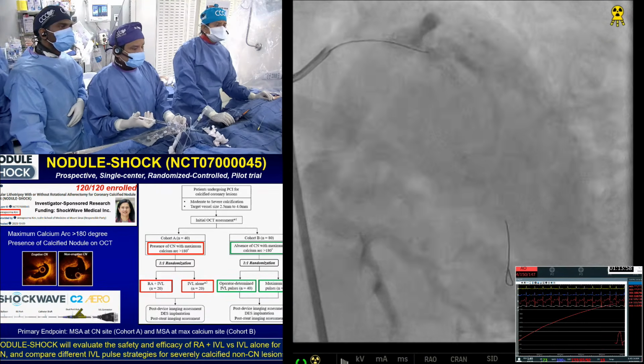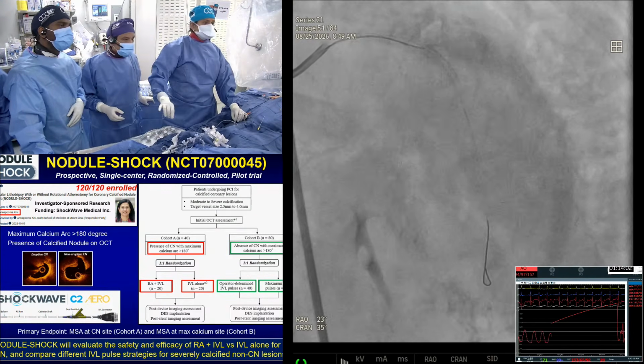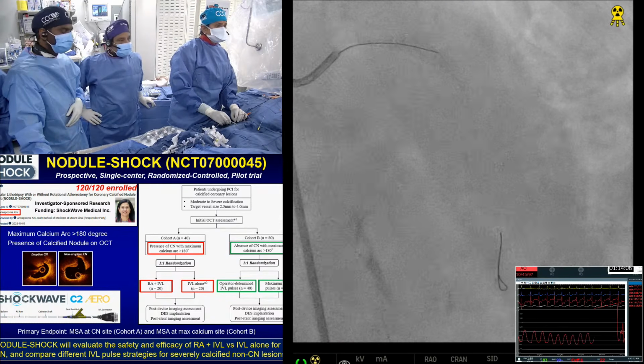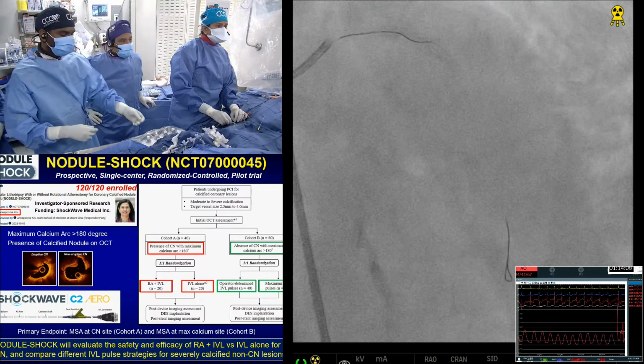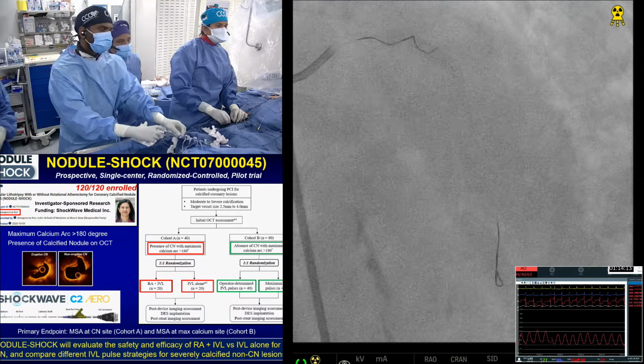Now, there is no contraindication in this case. If you want, you can get a bolus of integrilin, because remember, in all the trials the side branches have shown less occlusion with the 2B3A. Although this will be a little different now, you're using it as a bailout.